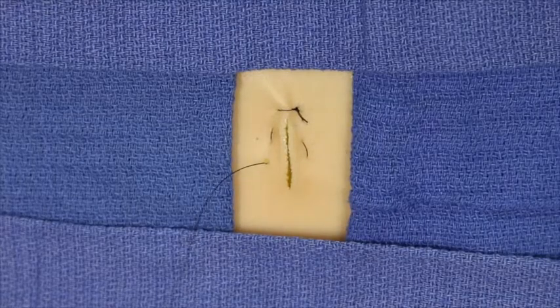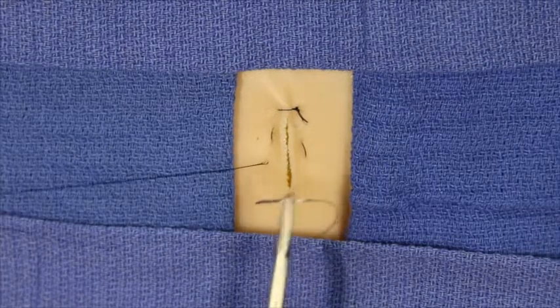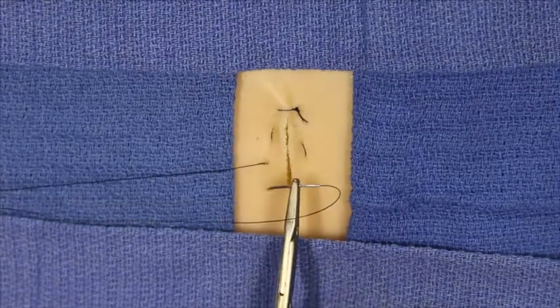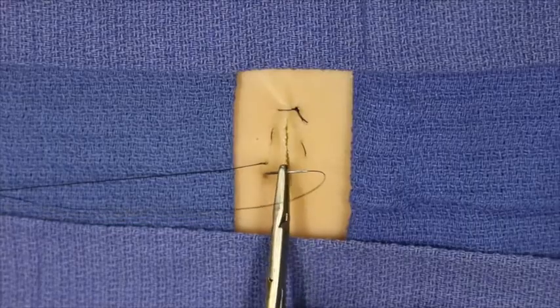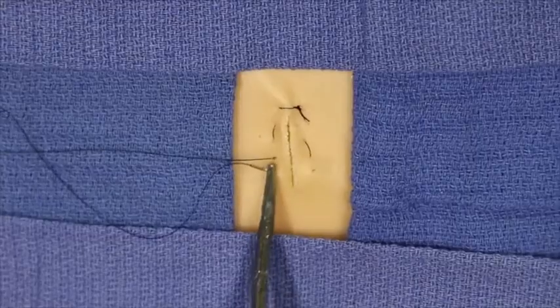You can notice the atraumatic wound eversion that we're seeing with this technique. Again, the needle inserts proximal to its exit point on the ipsilateral side, exiting on the contralateral side of the wound edge.